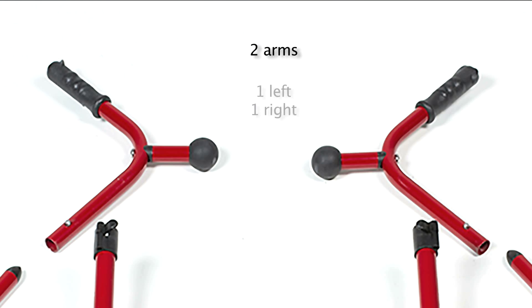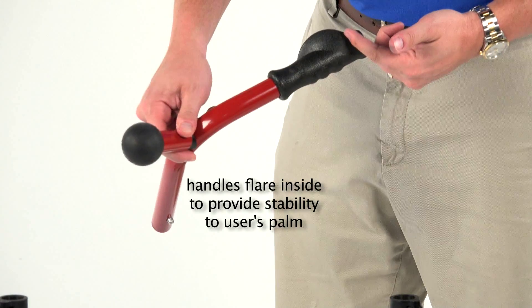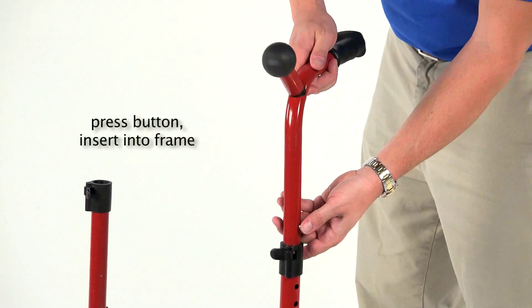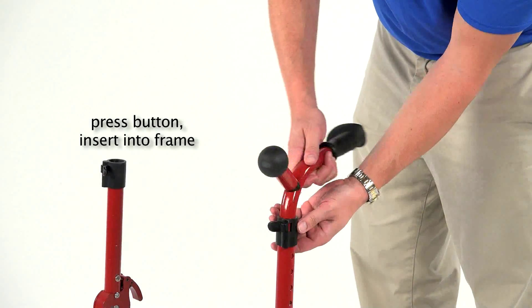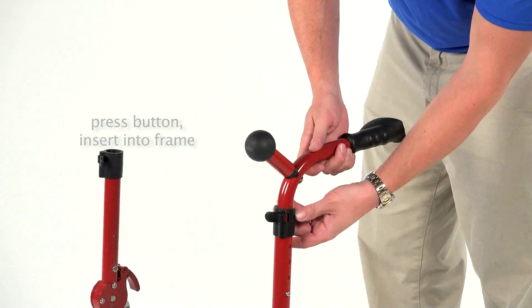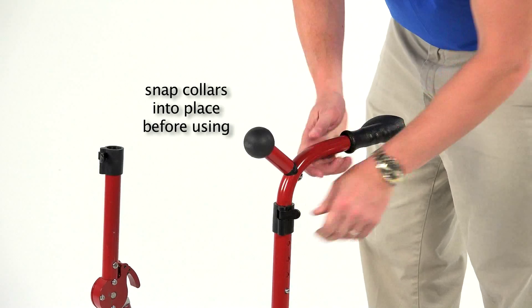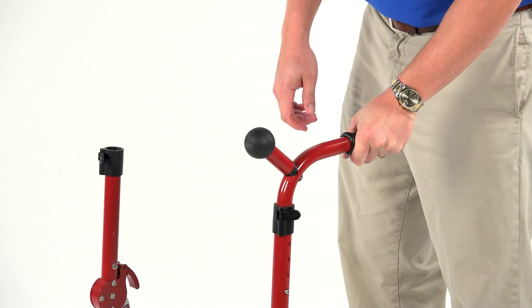There are two arms, a left and a right. The handle grips flare inside to provide stability to the user's palm. To install, simply press the push button on the arm and insert it into the telescoping frame. Once in place, use the snap collars to ensure a snug fit. This requires some pressure to perform.